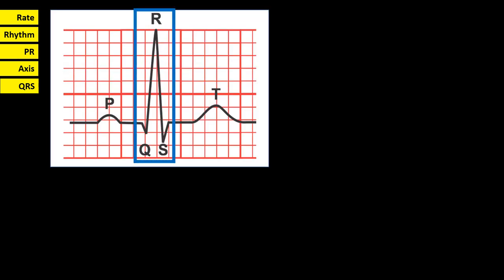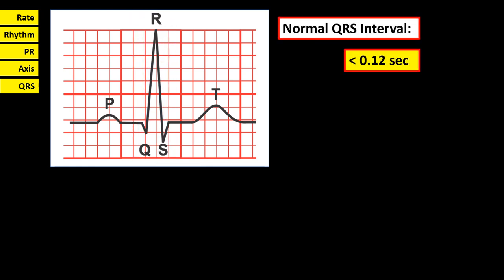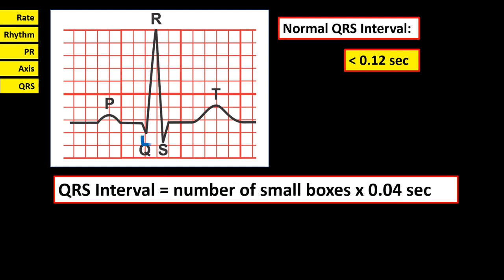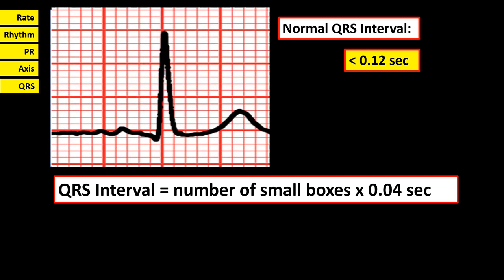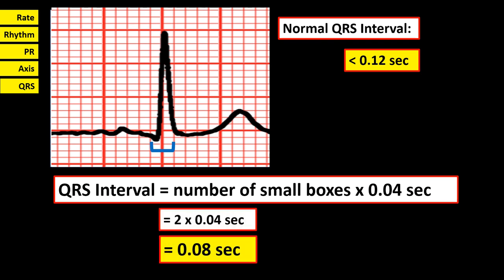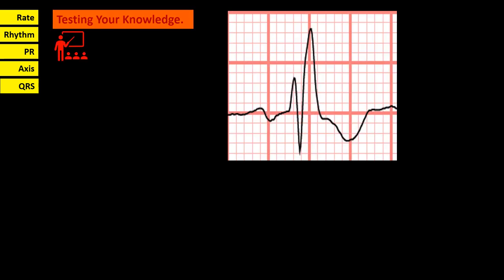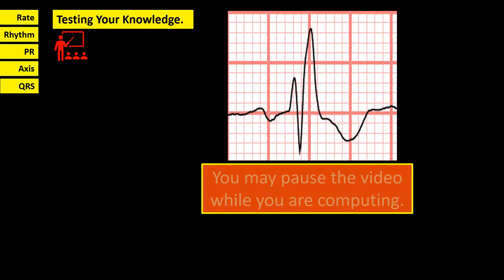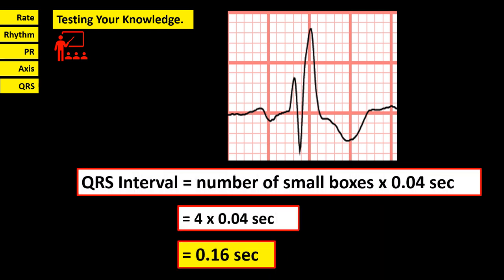We are done with rate, rhythm, PR interval, and axis. The next step is to determine the QRS complex. The QRS complex has three components: the Q wave, the R wave, and the S wave. Normal QRS interval is less than 0.12 seconds, or less than three small boxes. To determine the QRS interval, count the number of small boxes from the start of the Q wave to the end of the S wave, and multiply by 0.04. In this ECG tracing, there are two small boxes, so the QRS interval is 0.08 seconds, which is normal. In this other example, if your answer is 0.16 seconds, which is prolonged, then you got it right.